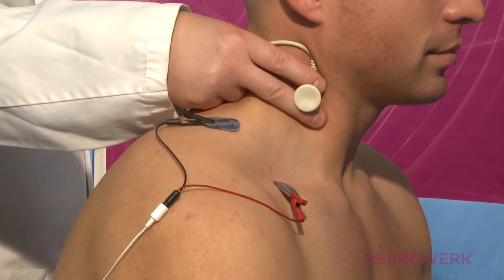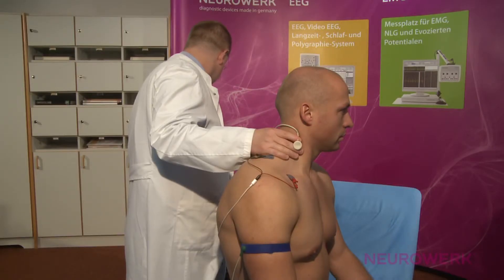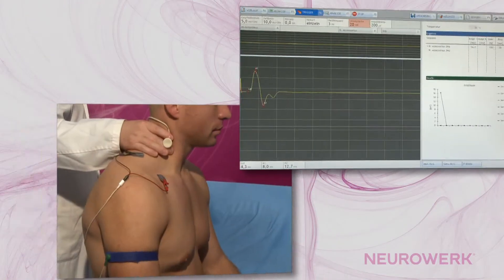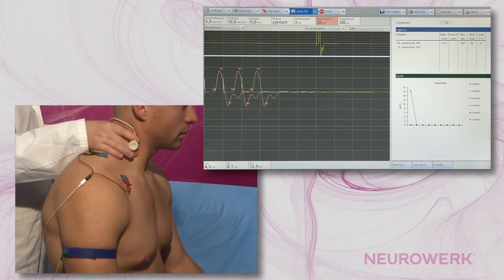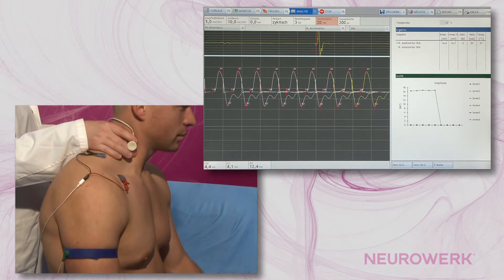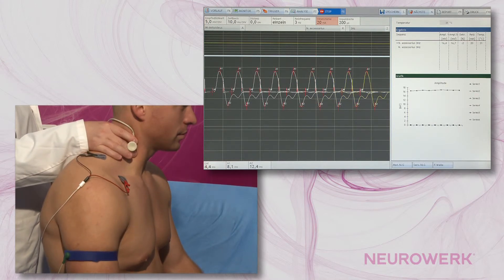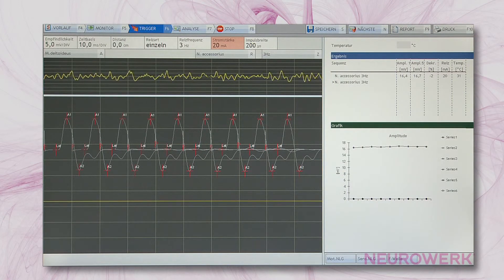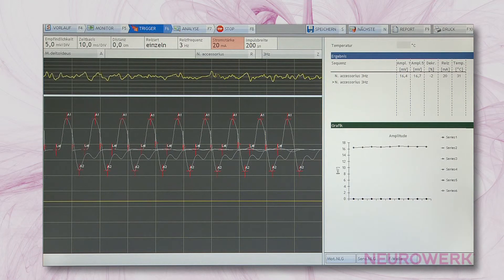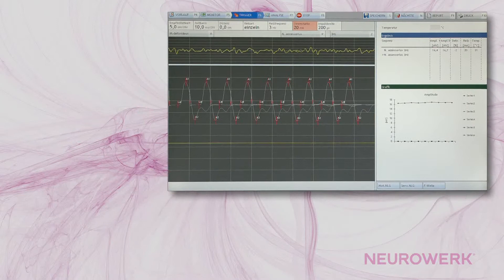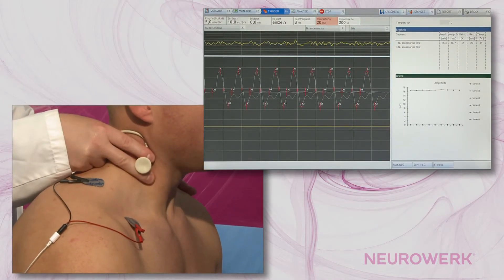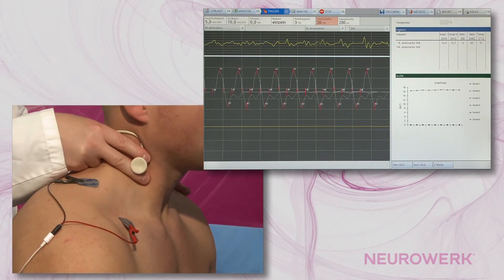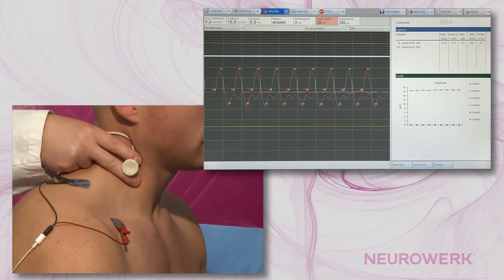Following this, 10 automatic stimuli are triggered consecutively. These will enable you to observe an obvious muscle contraction in the patient. Following measurement, the patient must maximally constrict the muscle for approximately 2 minutes, and should move his shoulder up against a resistance. During the phase of muscle contraction, it is recommended to keep the stimulation electrode at the neck to avoid repositioning of the stimulation position.